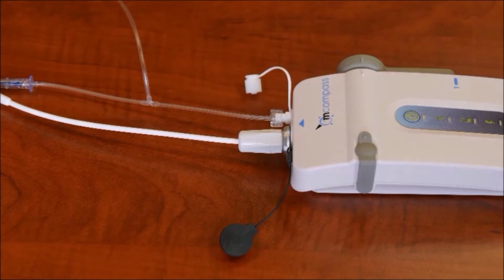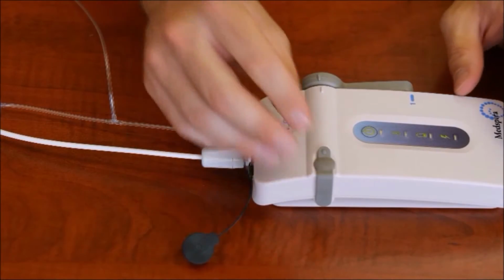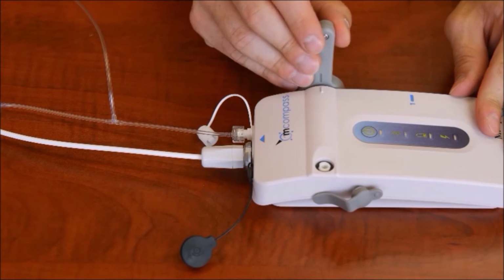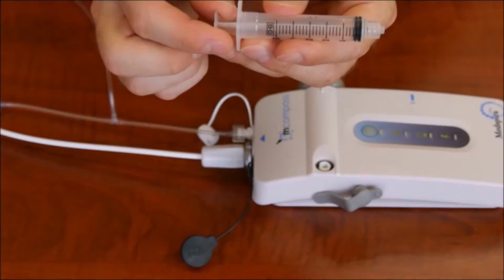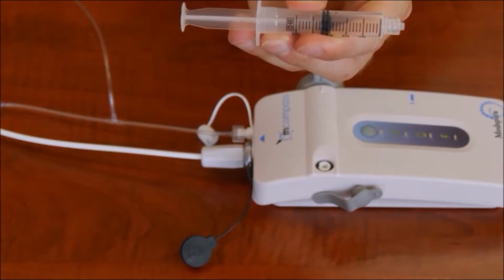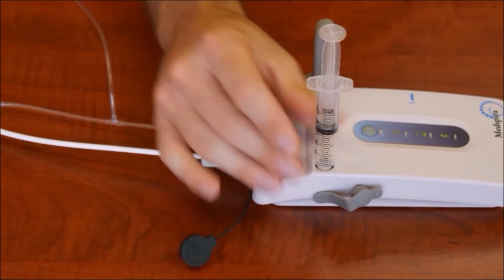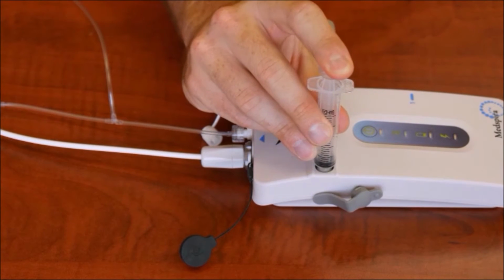The only time you will manipulate the sphincter balloons is during the priming stage. Open the strap on the left side of the fob and make sure the lever is in position 2 or open. Using the 5cc syringe, draw back 3 cc's of air. Place the 3 cc's of air into the priming port, remove the syringe and then count to 7 1000.